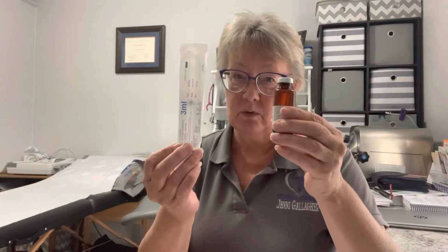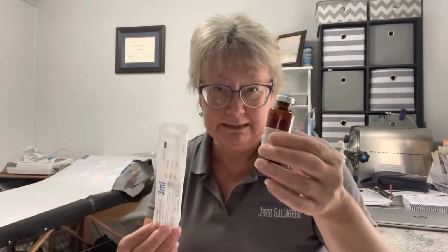So what we're going to do is give a B12 injection to myself. The first thing we're going to need is our medicine. You need to understand your prescription. So if you're using 1 ml or half a ml or 1.5, whatever your amount is, you follow the directions on your label carefully. We're going to start with a 3 ml syringe, an alcohol pad for the bottle of medicine, and an alcohol pad for my leg, which is where we're going to inject today.